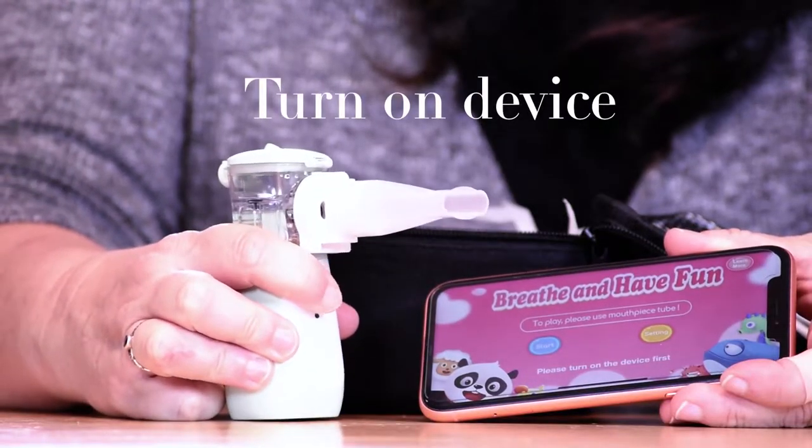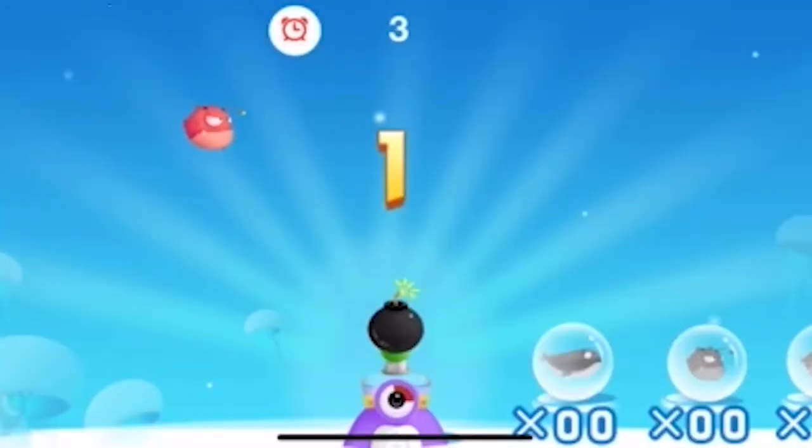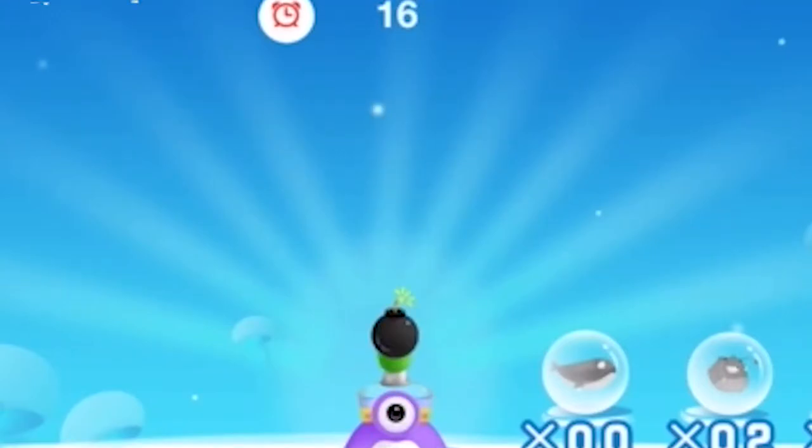So let's see if we can get it to connect. Turn on the device. Make sure you make a tight seal with your lips around the mouthpiece. This device will automatically shut off after 15 minutes.